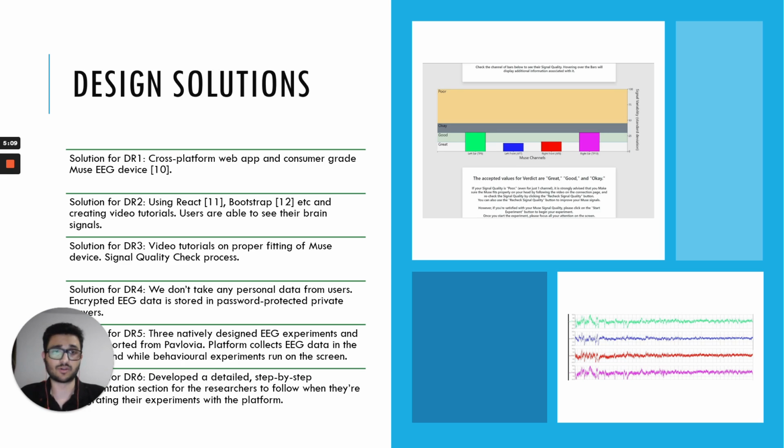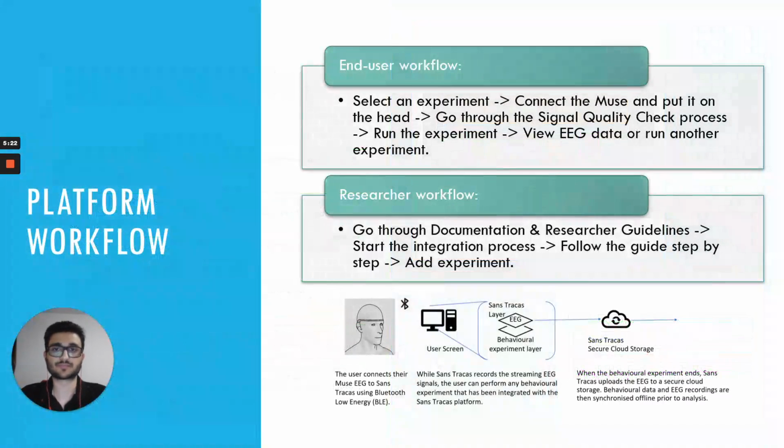For the solution of ease of use for researchers, we have developed a detailed step-by-step documentation section so that the researchers can follow this to integrate their own experiments into the platform. The end-user workflow: the end user would select from the list of experiments, connect the Muse device, and put it on their head.